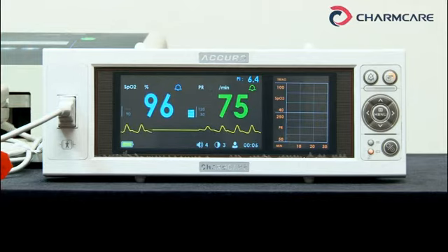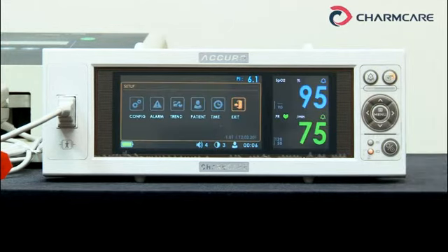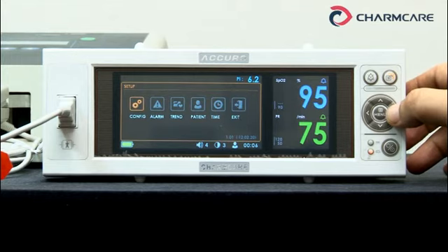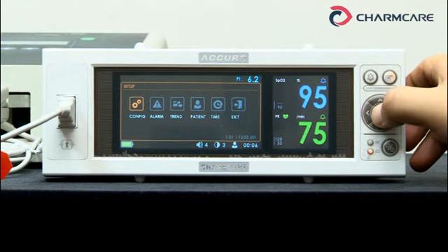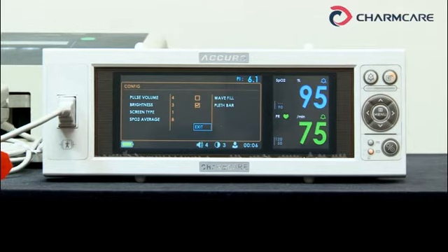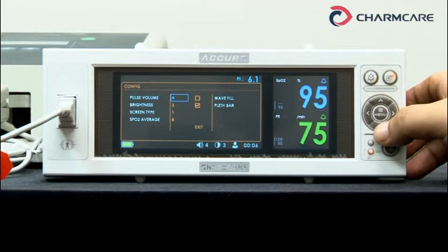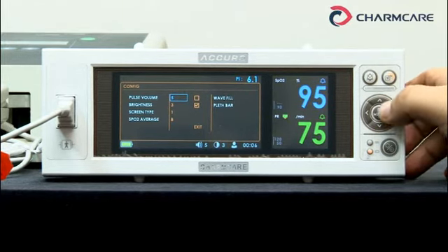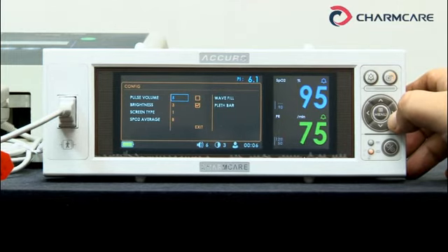Now let's learn how to use the setup menu. Press the menu button. When this screen appears, you can navigate like this — let's get into the configuration menu. Pulse volume goes from 0 to 7. Let's adjust it — it's bigger now. It's 0, no sound. Let's make it as high as 7.